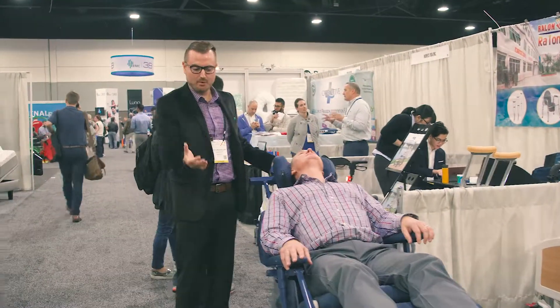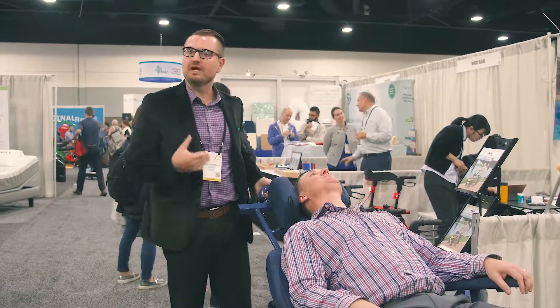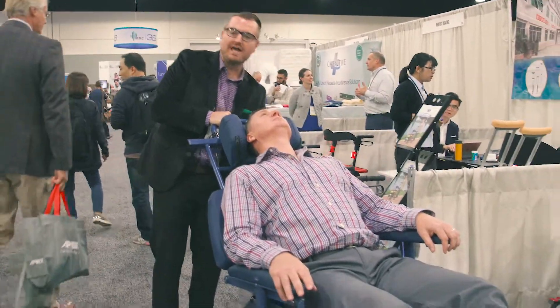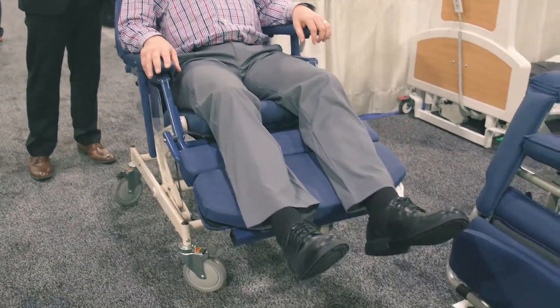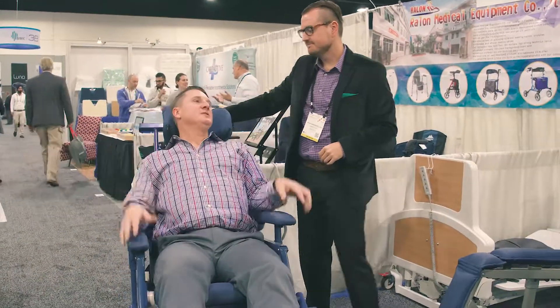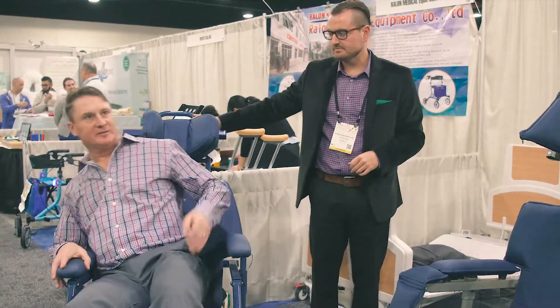You can really feel the pressure points changing as you lay back. Whether you want to get out just to get out, or get in for a therapy session, it gives you a lot of different functionality. Just a minor change every few minutes changes complete pressure points, so you can really aggressively target and untarget areas that would be difficult. As the pressure shifts to the scapula region, you can transfer it more to the backside — the coccyx.